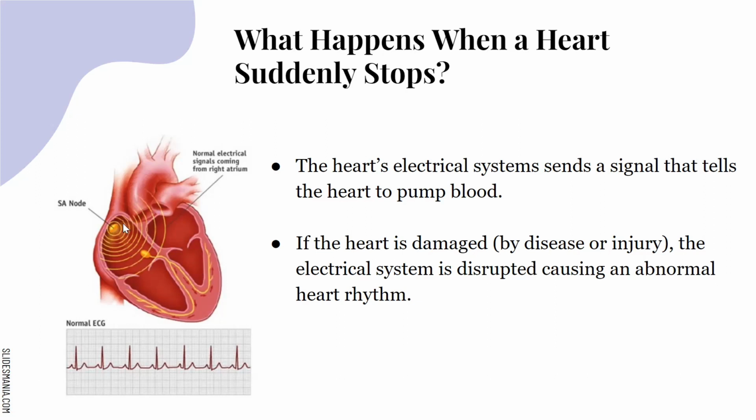In the hospital setting, or when you get on an EKG, if you notice at the bottom, this is the normal EKG rhythm that you see here. This is pretty much what you see on movies and things of that nature. And not to get too detailed about reading the EKG, but you have your P wave, you have your QRS, and then you have your T wave over here. So this is letting us know that the heart is pumping like it's supposed to, and everything is in what we call homeostasis, or in balance.